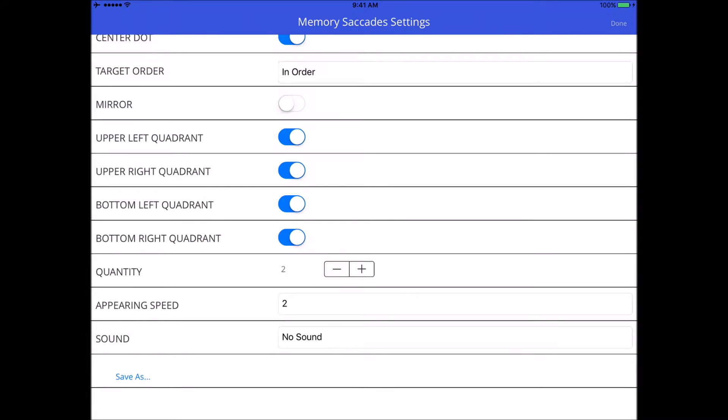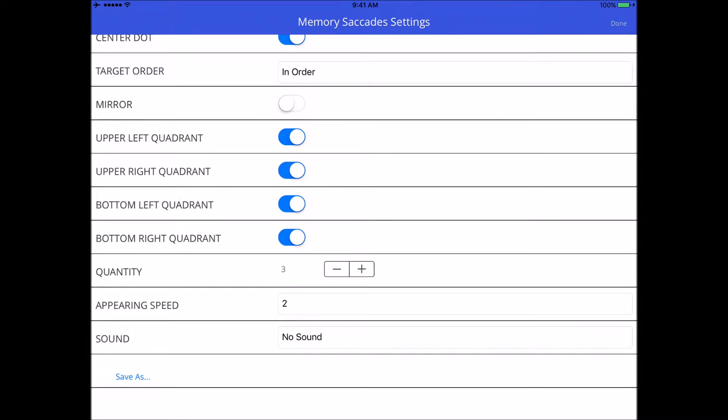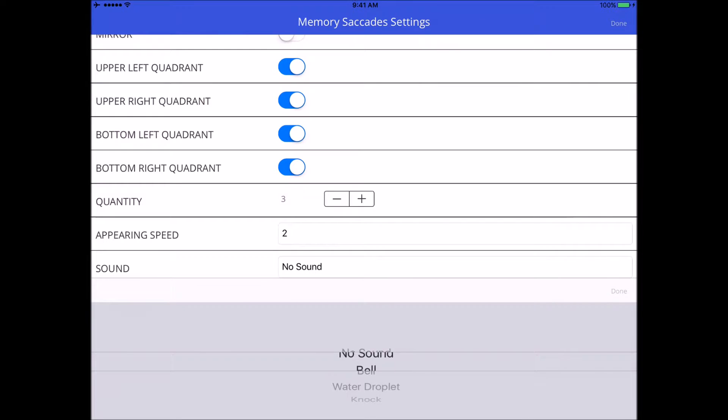We'll turn mirror off for now so you can see what this looks like. Quantity is the amount of targets you want to appear and have to remember — for demonstration purposes we'll keep it low at three. Appearing speed is just how much time you want between each target; I've set it at two seconds, so we'll leave it there.